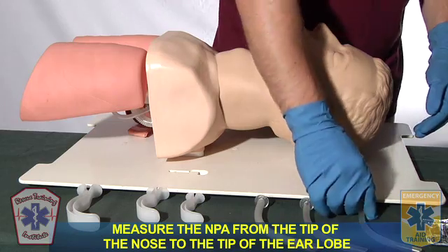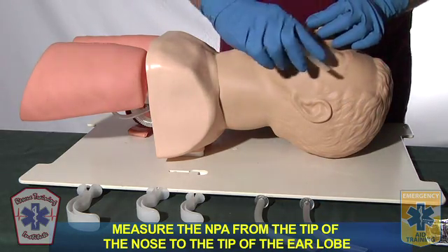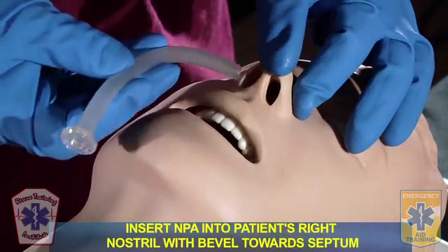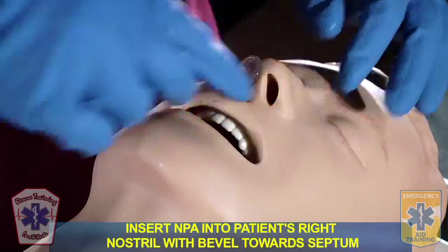Please demonstrate how you would insert a nasopharyngeal airway. I'm going to select my appropriate size nasopharyngeal airway by measuring from the tip of the nose to the tip of the earlobe. I will lubricate my nasopharyngeal airway with water-soluble jelly. I'm going to insert my airway into the patient's right nostril with the bevel facing towards the septum.